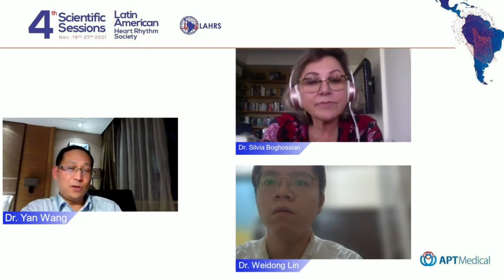I have never encountered this case, but according to your opinion, I think it's very good. It's helpful. At first you think it's focal, because in the activation map it looks focal, but after entrainment, it may be two or three sites. It should be a reentry, right? Yes. In this situation, we need to think about whether there is some epicardial place we can't map. Yeah, so it's a good idea.